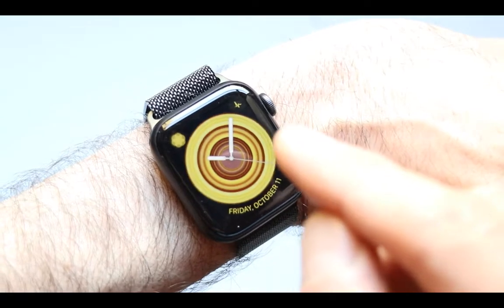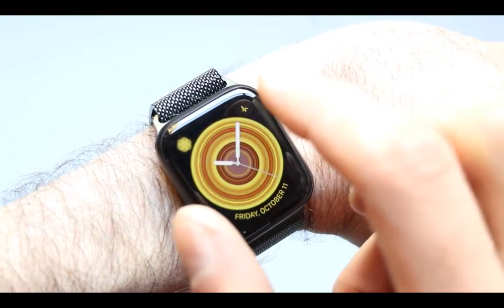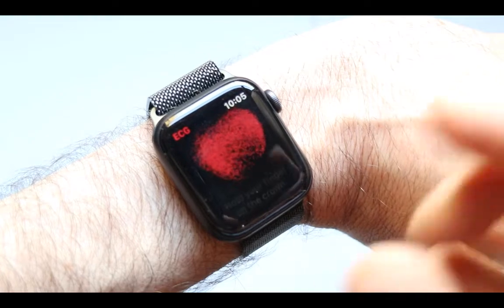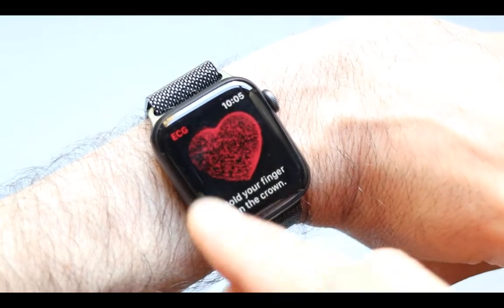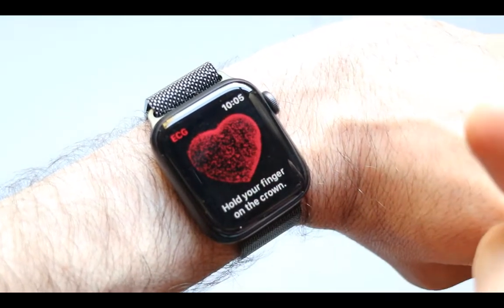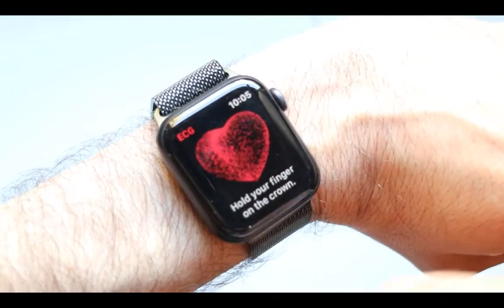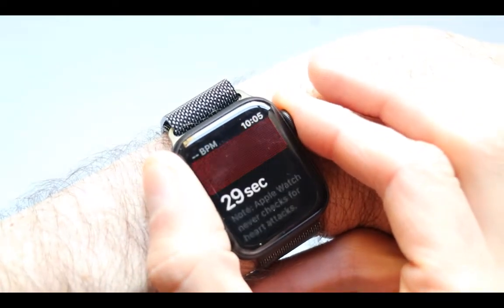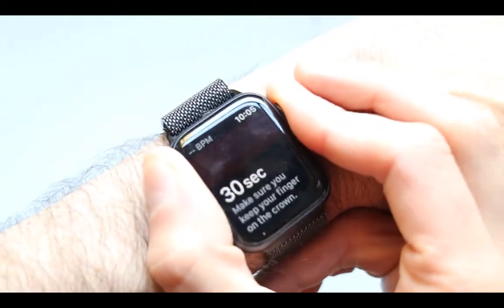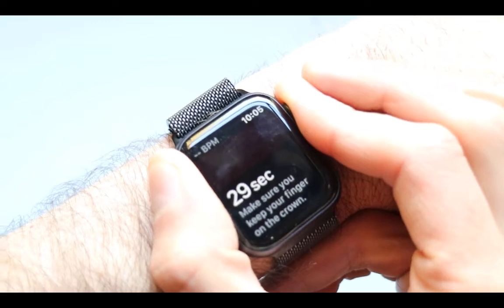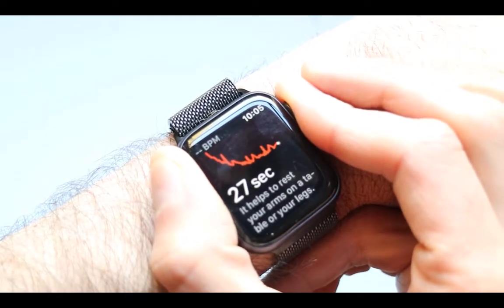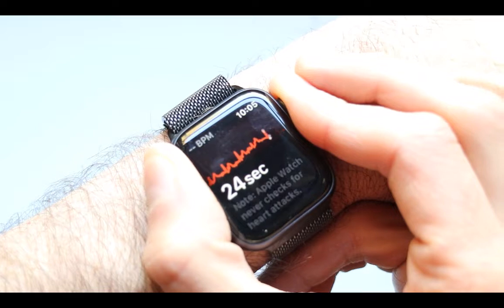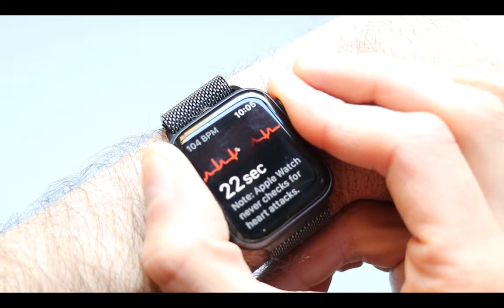Now if you want to get started and get this to work, all you have to do is press on it once right here and you'll see the heart icon come up. Then to get it working, press on the side of the watch and hold it for 30 seconds. Make sure it is stable and you are not moving.